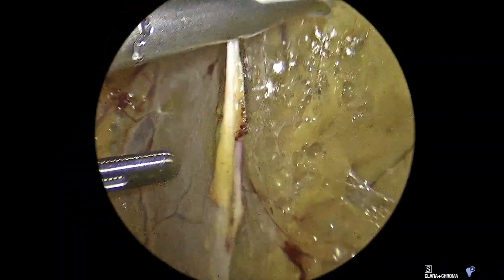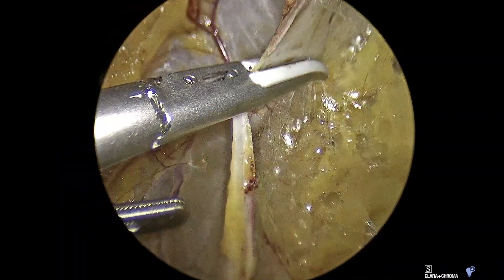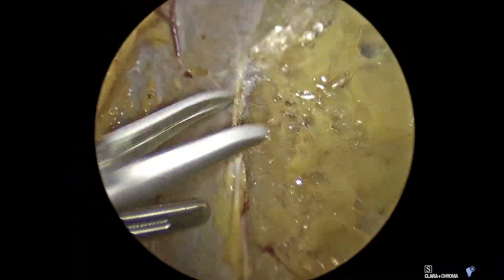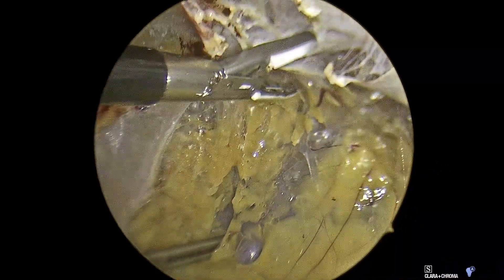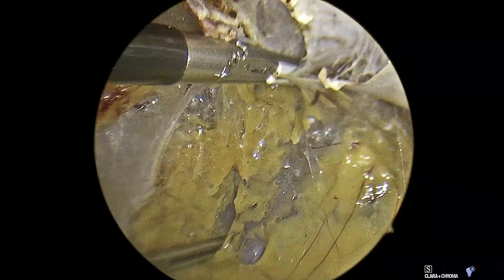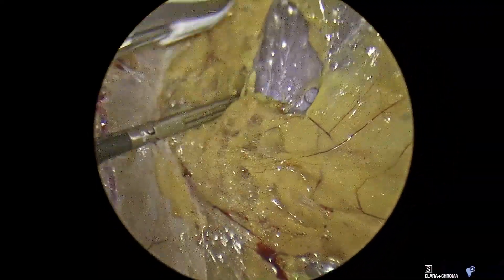Hello, I'm Tobias Karling from the Karling Adrenal Center. Thank you for reviewing this video. You will see a completely unedited left adrenalectomy operation. The left adrenal tumor was removed in 5 minutes and 57 seconds. The patient is undergoing a left mini back scope adrenalectomy. What you see is exactly what happened during the operation — the video is unedited and is not sped up.